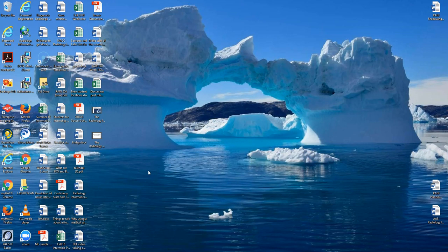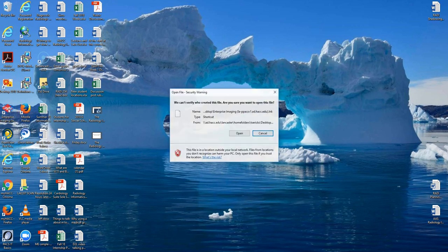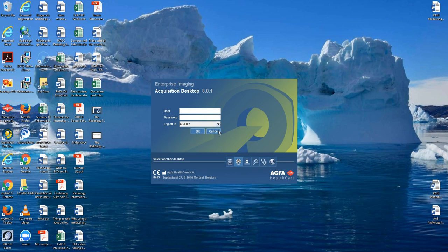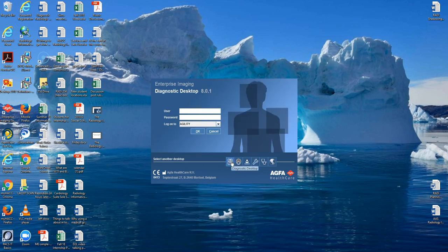We've been talking about PACS a lot in these early videos, and today I want to show you the PACS system in action. When you go to launch the PACS system, look for the AGFA icon, double left-click, skip past that, and it will bring you to a pop-up that has the different desktops on it.